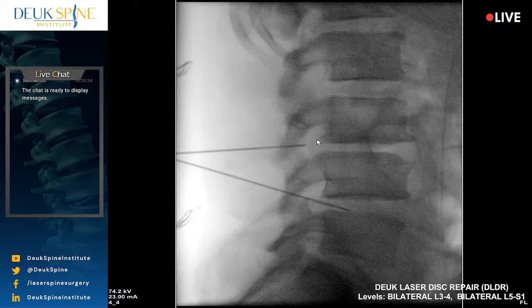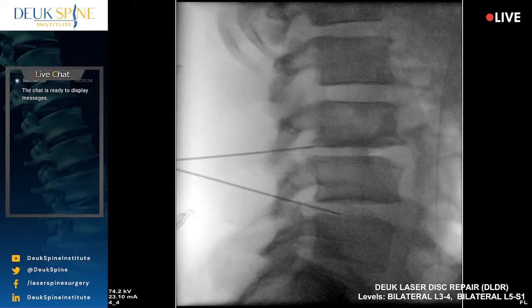Yep, right there. A big bulge. So we're touching it right now. I can feel it. Any pain in your leg? Just your back? Yes. Okay. How long have you had the back pain for? How many years? 9. Are you looking forward to getting rid of it?